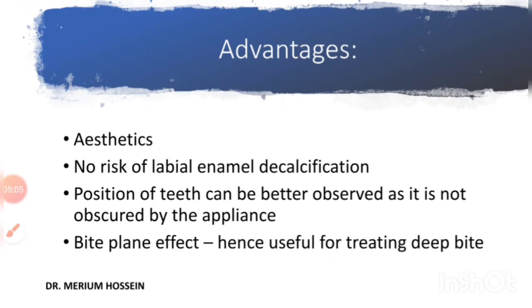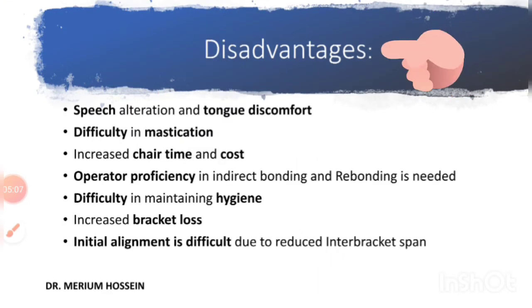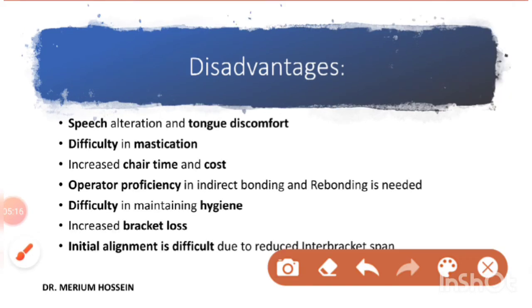So let's move on to the disadvantages. The first disadvantage is that there is going to be speech alteration and tongue discomfort. We know that a lot of sounds are produced by the tongue tip touching the palatal surfaces of the upper incisors. So there is going to be speech alteration, obviously. And then the second thing is that there is going to be tongue discomfort.